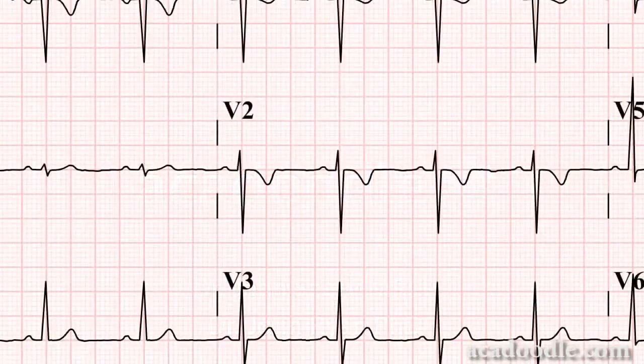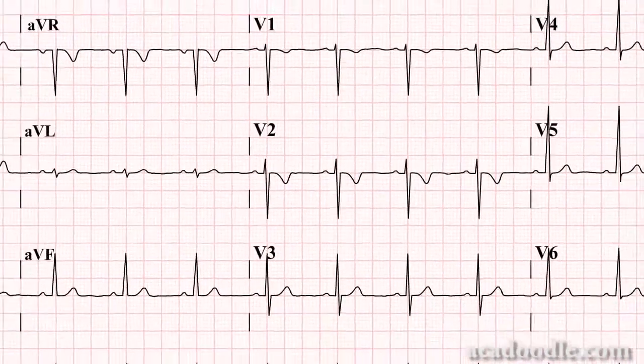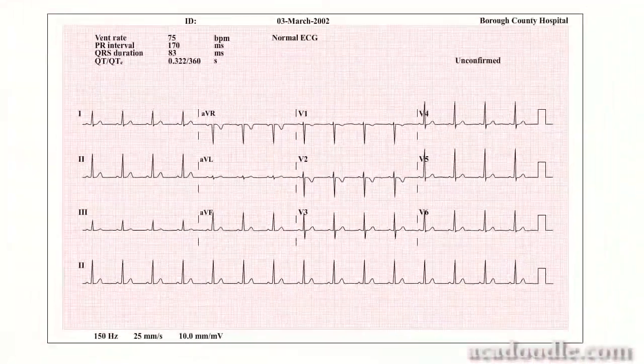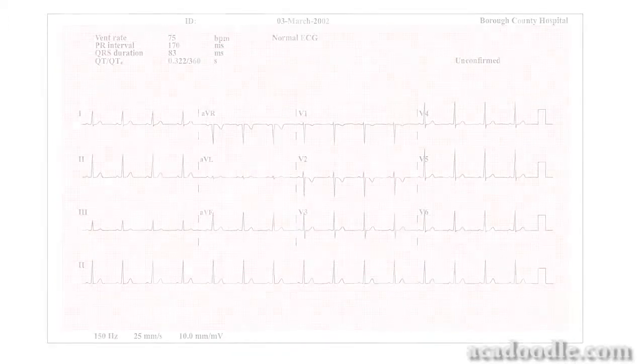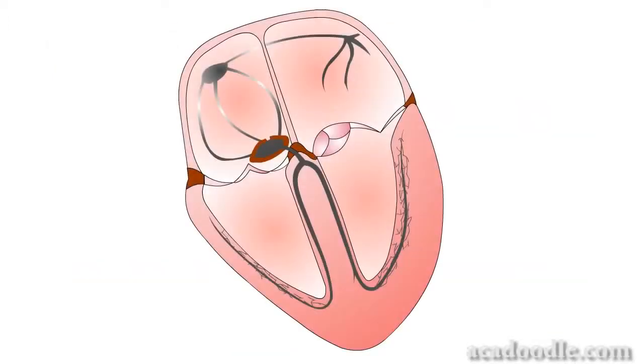In this video, we briefly review the processes of cardiac depolarization and repolarization. We will focus only on those points most relevant to understanding the ECG readout. We will work mainly with the 2D schematic of the heart shown here.